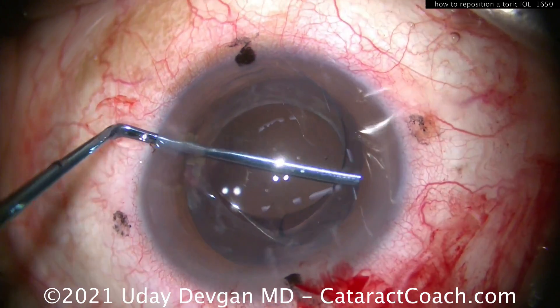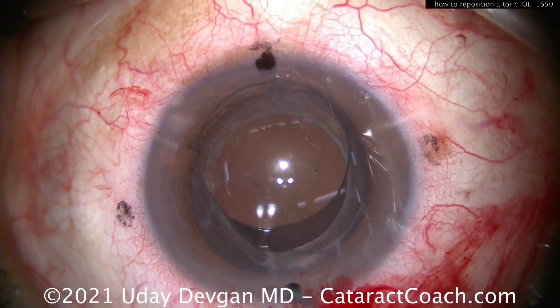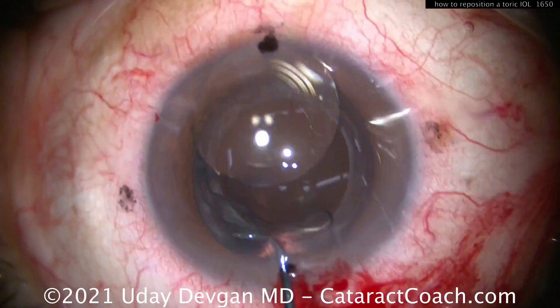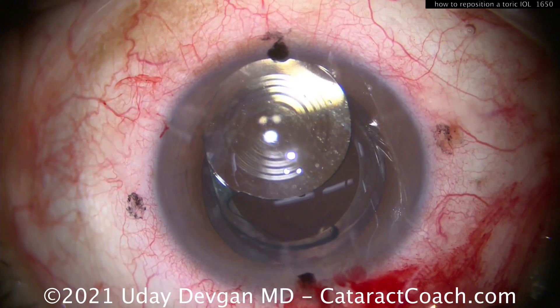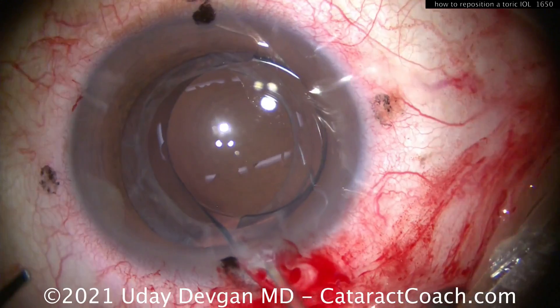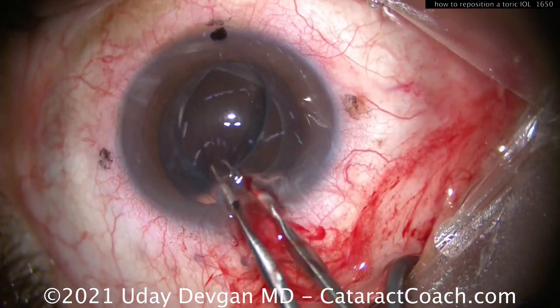Go in again, nice and gentle, all the way out to the equator. Notice how the spatula's rounded off on the tip. Now try one more time — now it's free. The lens is up out of the capsular bag and you can reposition it wherever you need to. Or in this case, we're actually going to explant it. But you can definitely reposition a toric lens even months later.